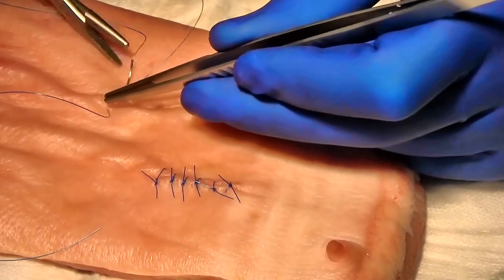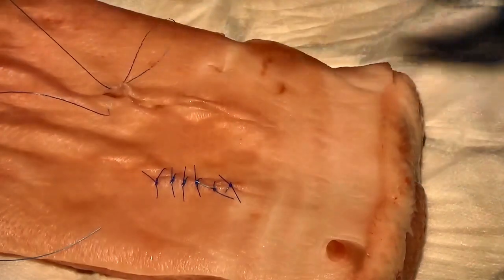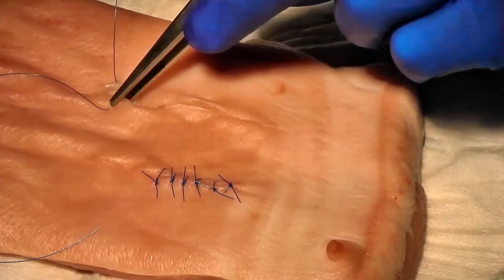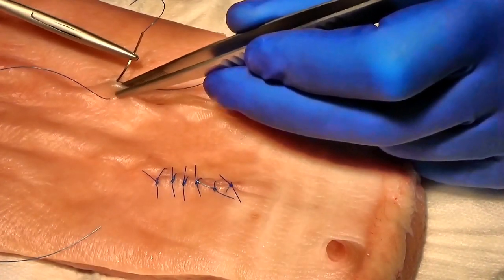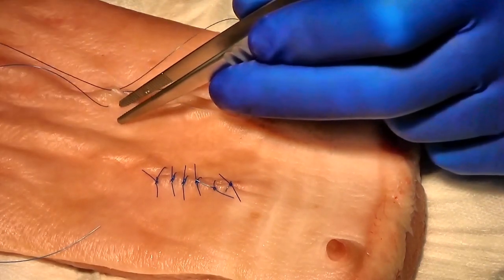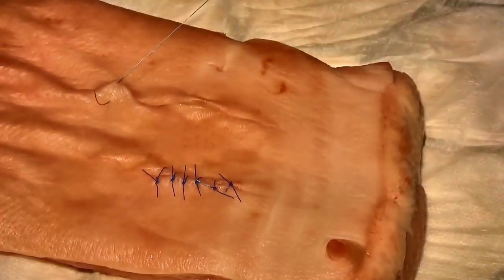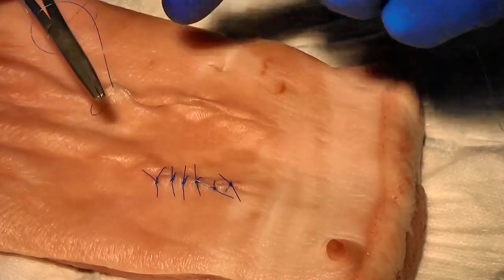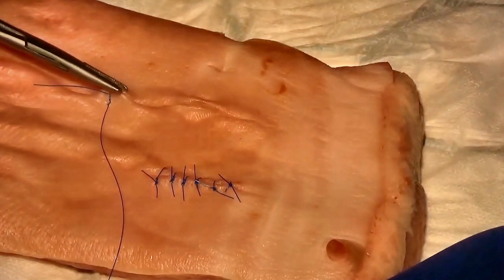Notice I'm doing each part of the suture separately. If you try to do it all in one, you'll end up with tearing of the skin. Go through between the dermis and the epidermis, very close to the edge of the wound, less than a millimetre away from the edge, and tie. And you can already see with just the one suture how it's beginning to evert the wound.